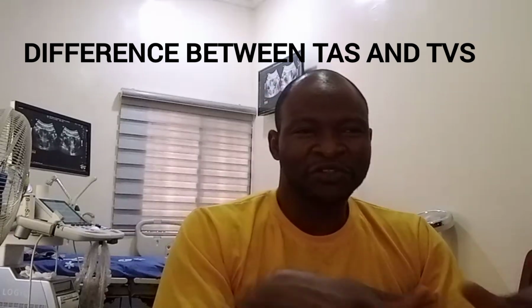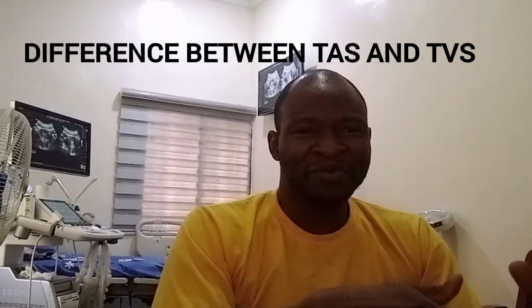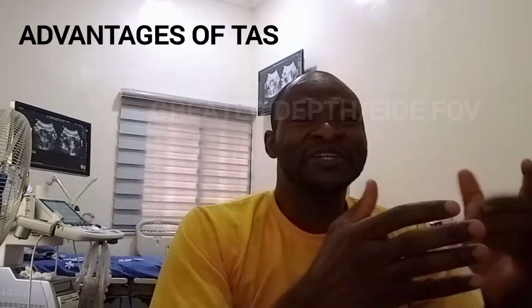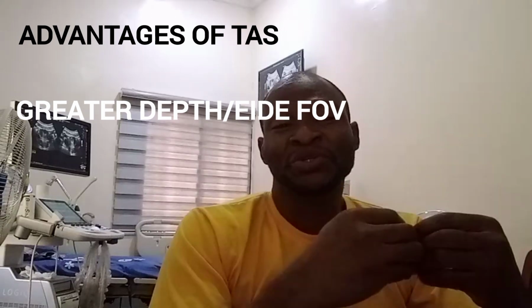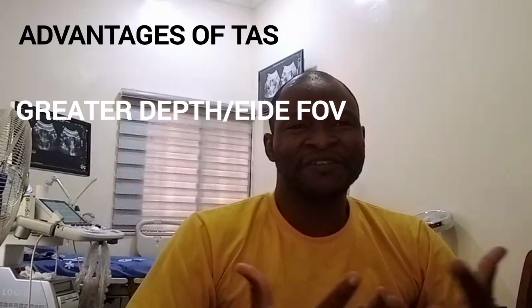Let's compare and contrast both techniques, how they complement themselves and how they are not mutually exclusive. So for transabdominal scan, the advantage is you have greater depth and field of view, and you can see the entire pelvis.